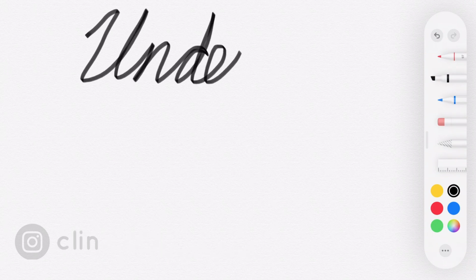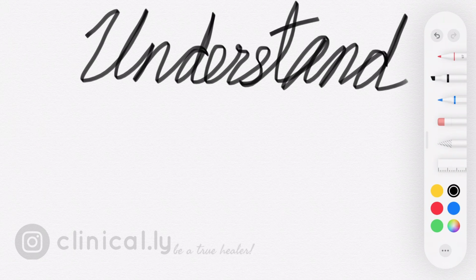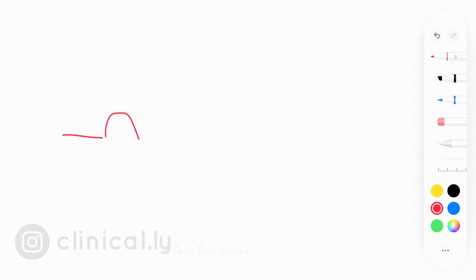Thank you for that. This is the second video of the series. We'll learn more about ECG in this video and in the upcoming videos. In the first video, we had learned about the newer way to approach the ECG. In this video, we will learn about the universally accepted conventions regarding the ECG.